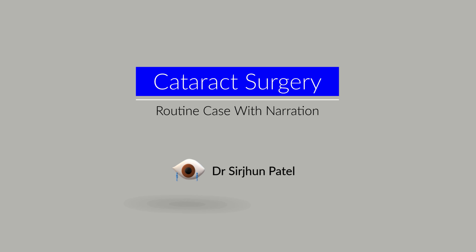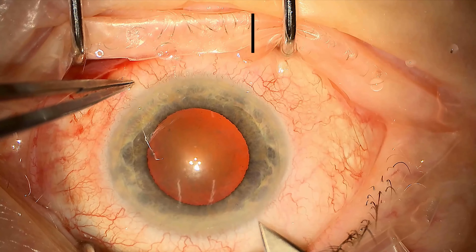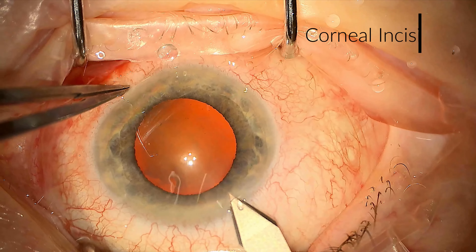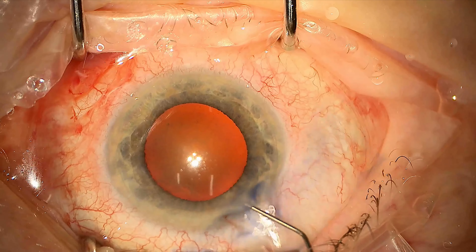In this video I'll be talking through the basic steps of a routine cataract operation. This operation was done under local anaesthetic and we're starting off with our corneal incision. This is a small incision into the eye which doesn't leak and allows us to access the cataract and remove it without requiring sutures later on.